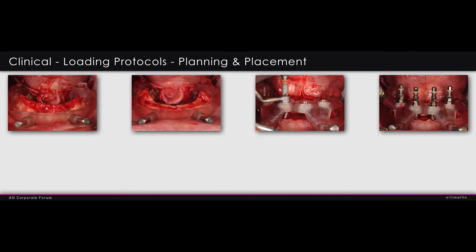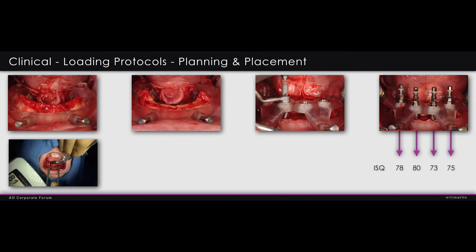So when we remove that bone, obviously we've removed some cortical bone, so we're going to want to place implants that are going to have a thread design that's going to kind of engage that bone in a manner that hopefully maintains that stability. But using a CT-guided approach is going to give us more precise osteotomies. It's going to take away from that vibration of free-handing something. It's going to give us a more accurate fit of these implants. So we have the potential, once these implants are placed, to maximize that primary stability and eventually immediately load it.